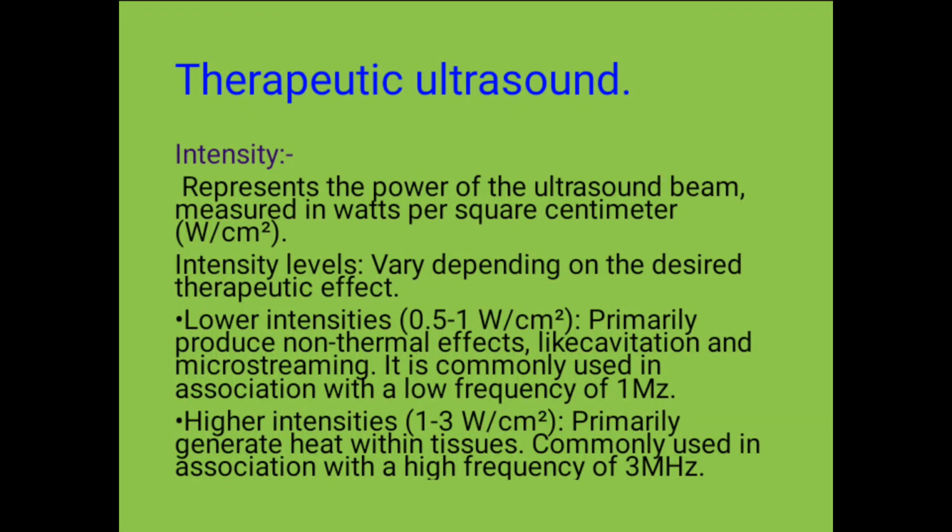So what are the intensities for ultrasound? And we need first of all to have a knowledge of what intensity is, so that we can dive in to understand it. And intensity just represents the power of the ultrasound beam. Intensity is basically the power of the ultrasound beam, and it is measured in watts per square centimeter. You can see from the projection that I'm making here.